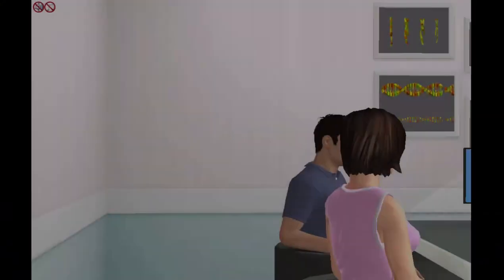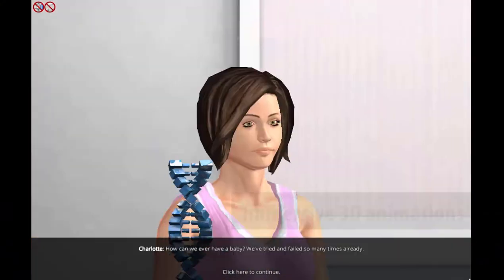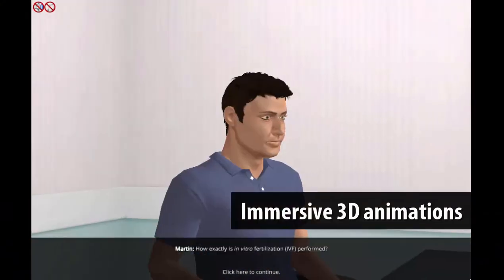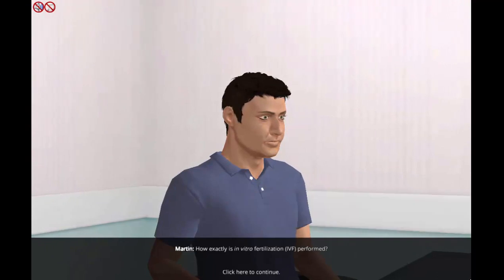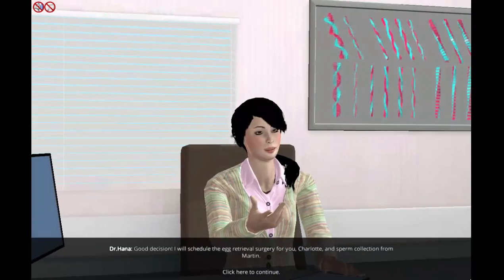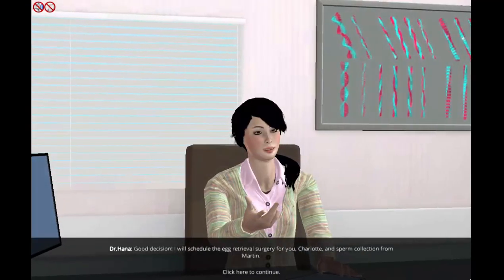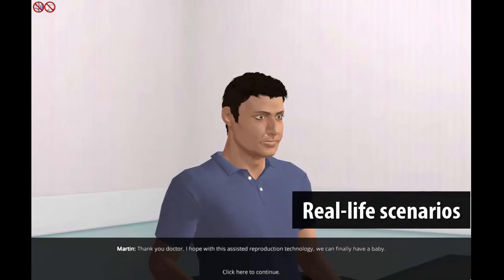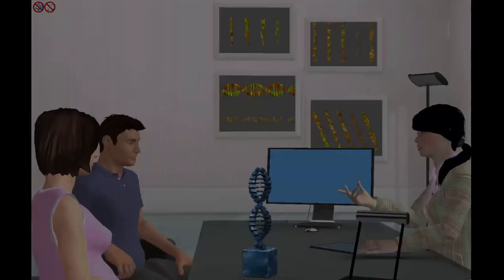The virtual lab starts with a story of Charlotte and Martin, visualized with immersive 3D animations. Students will be responsible for performing in vitro fertilization in order to help Charlotte become pregnant.